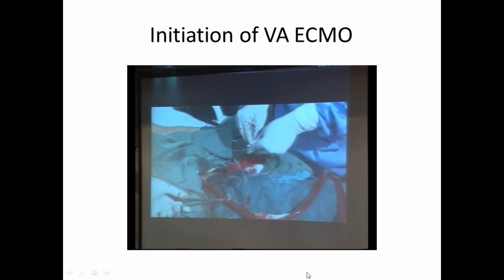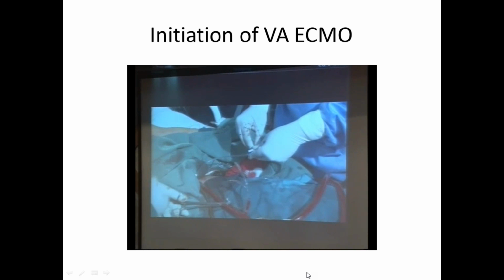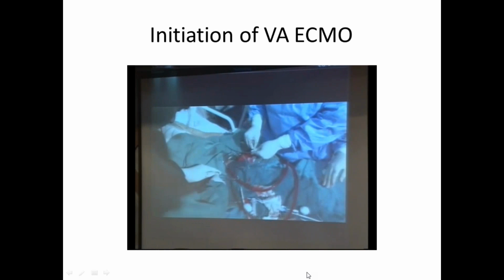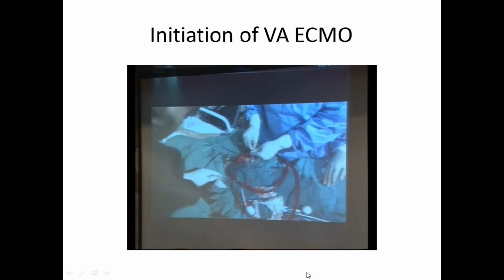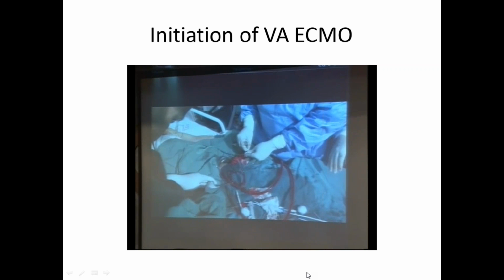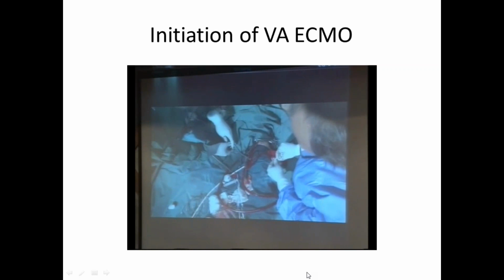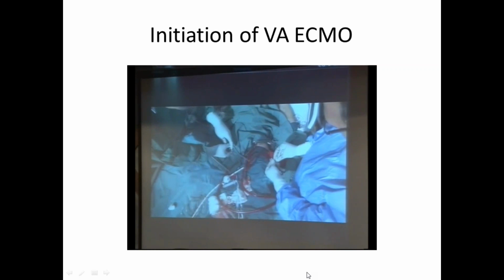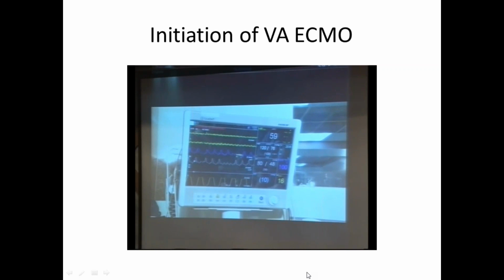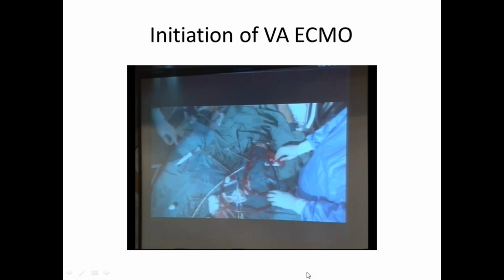So we have kept the artery line clamped. Now we are removing the air bubble from this line, and this line is going to be connected to the distal perfusion cannula, which has been put through the antegrade puncture, the 7-French cannula. Once we de-bubble it, we'll put it. We have connected it now. We'll open it. Pressure 78 by 48, a mean pressure of 60.